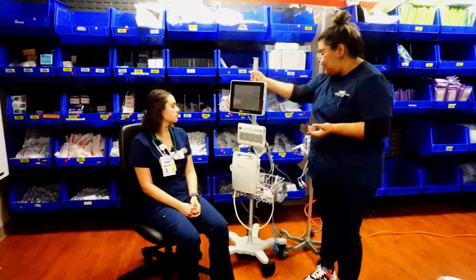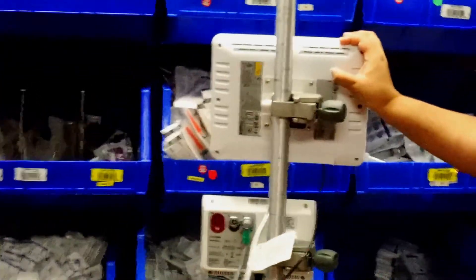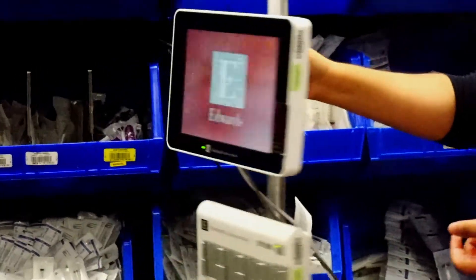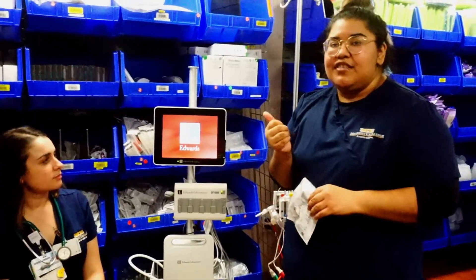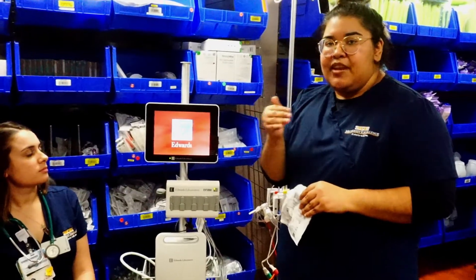The on button for the EV1000 is in the back. Press the power button and that will turn the machine on. When the machine turns on, it's going to ask you about the patient — their ID number, height, weight, and whether they're male or female.